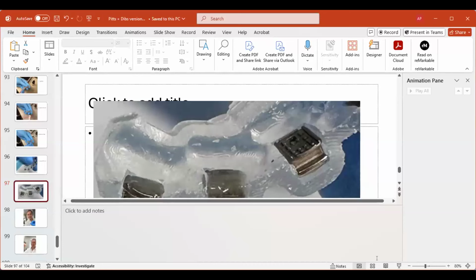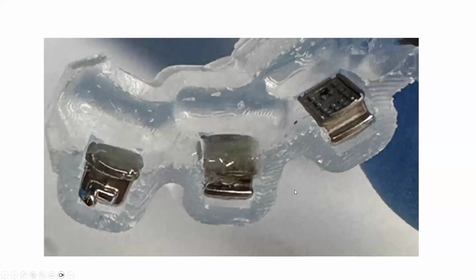Okay, excellent. That actually answers the other question I had, which was, do your assistants go over each case in the software beforehand so they know if they need to place extra adhesive? And it looks like they discover it basically as they're putting the adhesive on. That is correct. When we first started, we instructed them to open up the software, go through it tooth by tooth, and see which ones had noticeable wedges. That's too time consuming. You can tell just by looking at the trays.